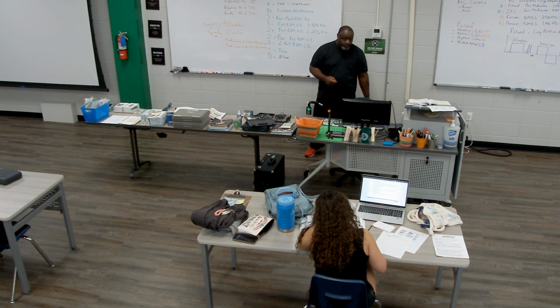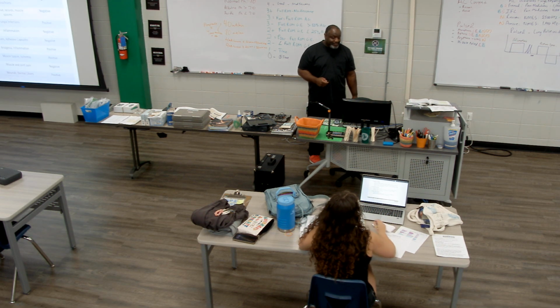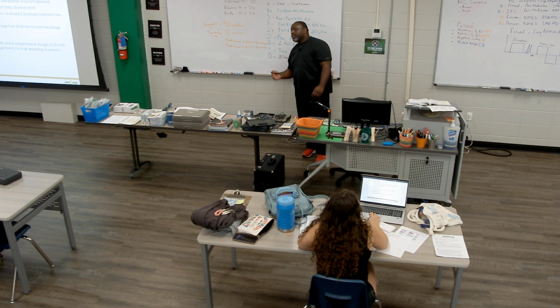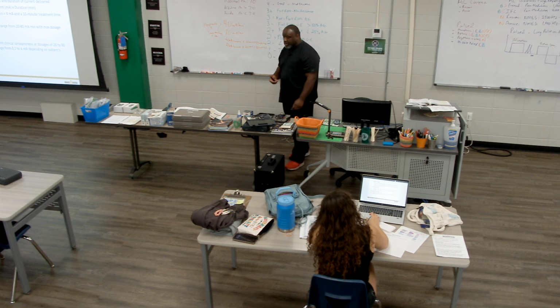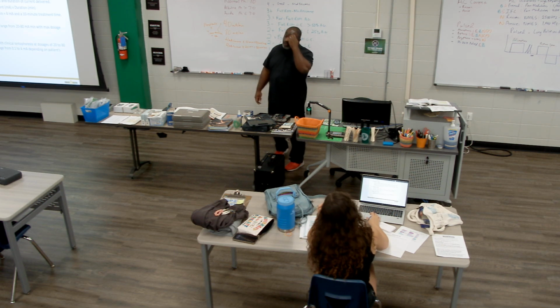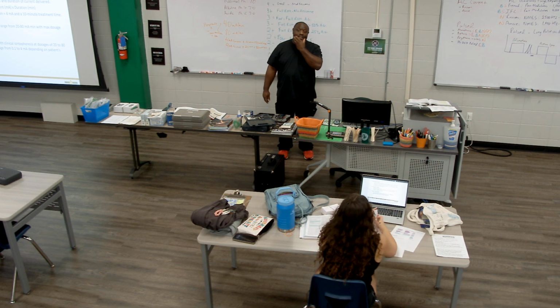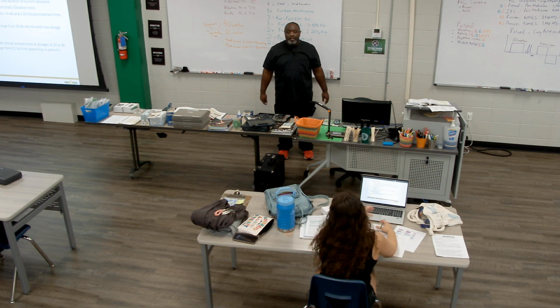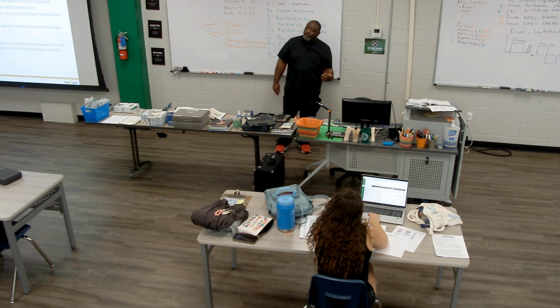Okay, so that is iontophoresis. The major thing is understanding that we use direct current. There is a charge that's built under the skin, so we want to be careful. We're using it to deliver medication to a superficial area in hopes that it's going to decrease pain by avoiding medication breakdown by the liver.